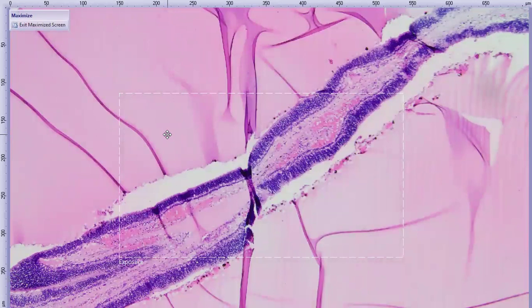There's a lot of it, but let's cut to the chase. Suspect retinal detachment associated with hypertensive retinopathy. They are concerned for neoplasia, given the medical history below, which we're going to get to. But the owners didn't want to do anything, so they've enucleated.